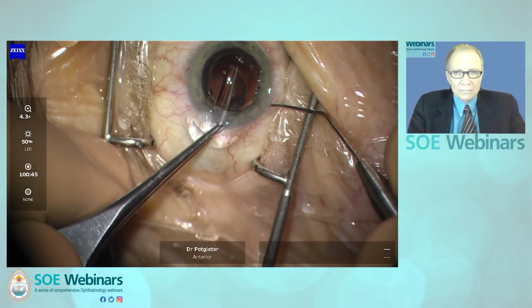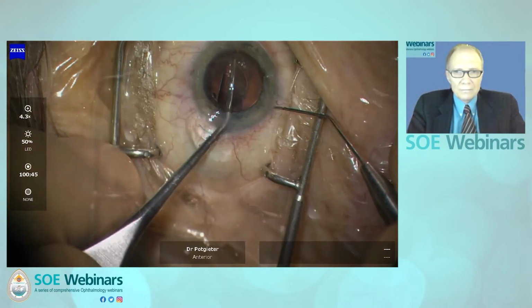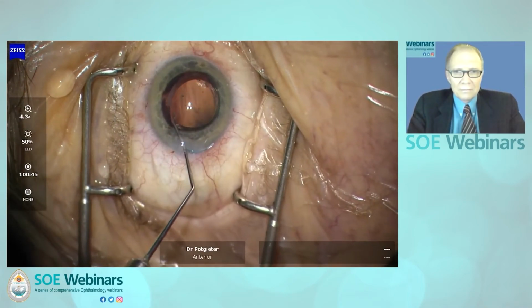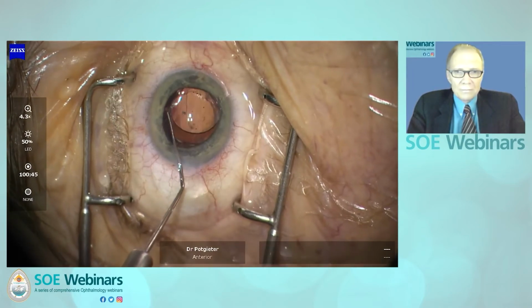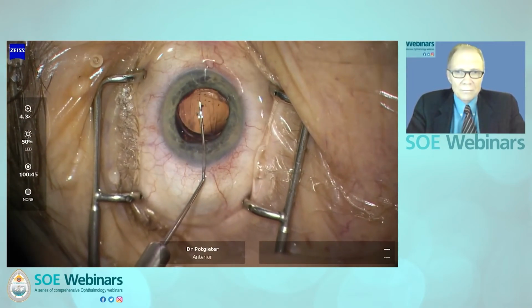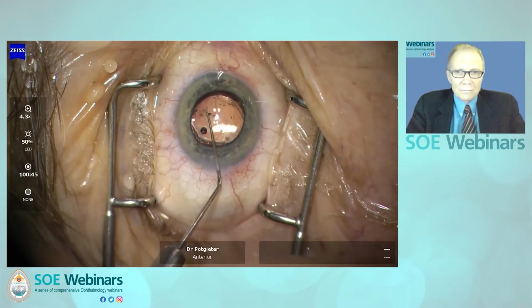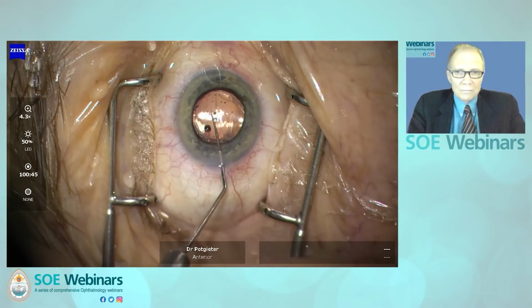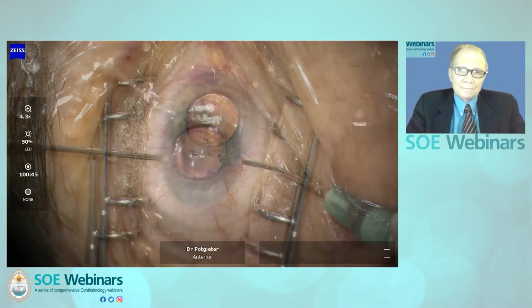After delivering the lens into the anterior chamber, the haptics were dialed into the sulcus. The optic was then pushed through the capsular defect into the posterior segment, while ensuring that the haptics remain in the sulcus. This has the benefit of trapping the vitreous posteriorly as the capsular remnant and optic of the lens restore the integrity of the iris lens diaphragm.